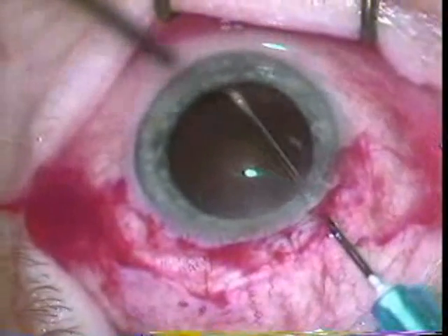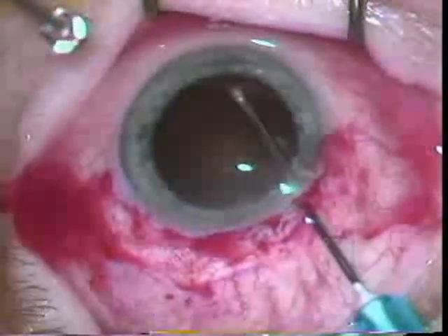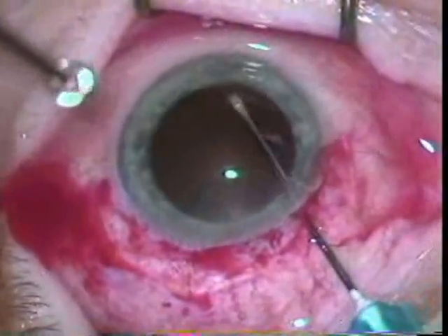Here he's going across with the cystotome. You can see he's making the can opener move where you enter and then go over to where you entered before. You do this around 360 degrees.